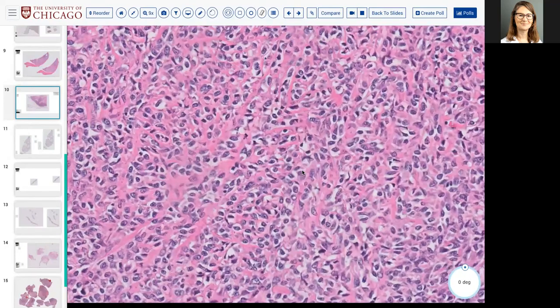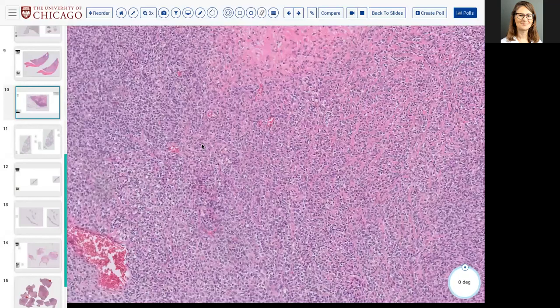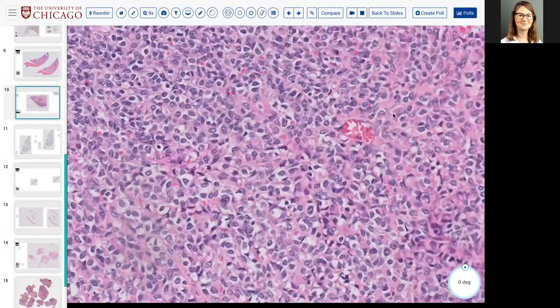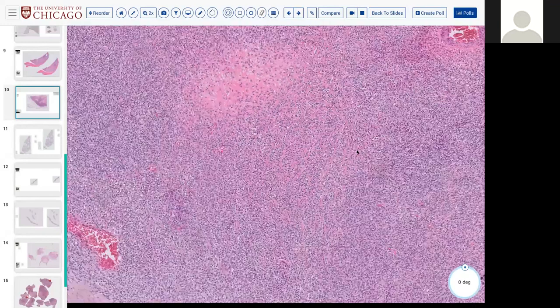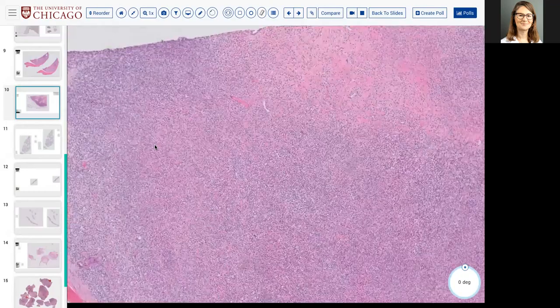I like them all. And we've got S100 negative, we've got Desmin negative, we've got MDM2 and DDIT3 I'm going to say negative. We couldn't get HMB-45. Sure, you want to exclude a melanoma, absolutely.